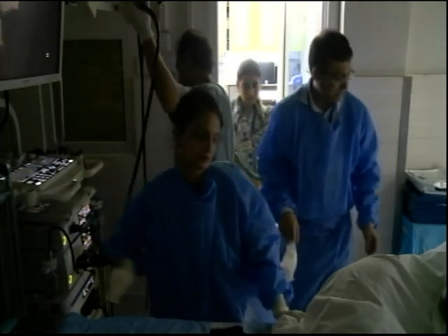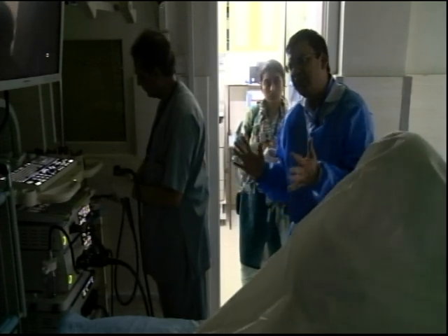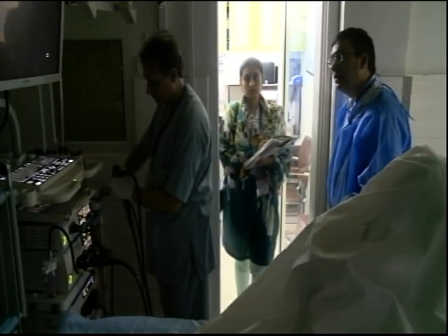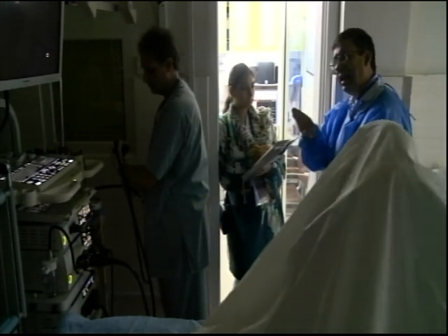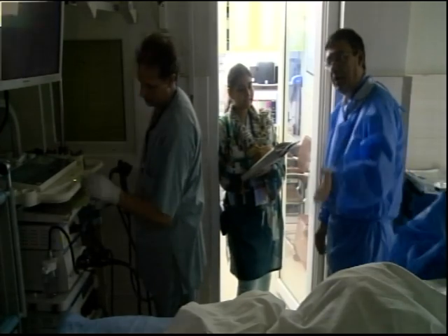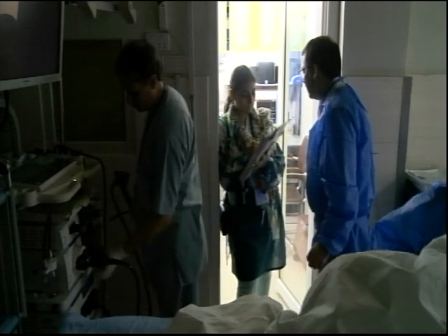So in rectal EUS, when you're using a linear scope, like you did, you went up to about 20, 25, looking for vessels, and then once you found the vessels, you just basically swept one way and the other. So linear is mainly used for FNA and some therapeutic purposes in the rectum. But again, to find that lesion you want to do an FNA for, or an abscess, you need to be able to find it. You've already seen how you're supposed to find it. You're actually sweeping 180 degrees. So you need to find either the vessel or the bladder and look at one time, then go 180 degrees to the other side, and then go back and again. You keep making back and forth movements up to 180 degrees. Slight wall thickening at the area of prior tumor. No mass noted. No lymphadenopathy noted.